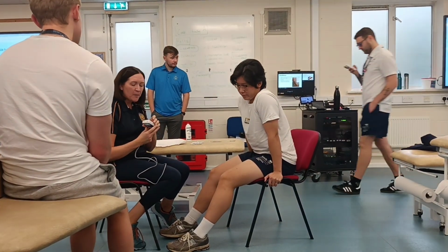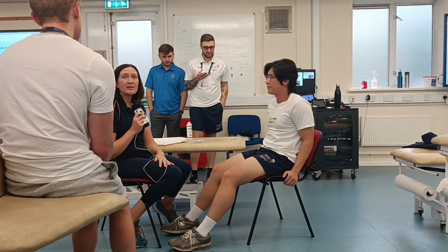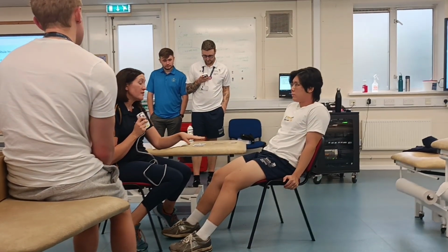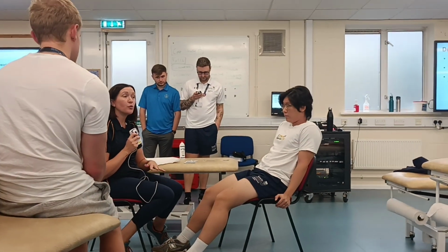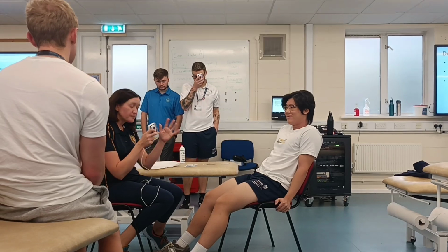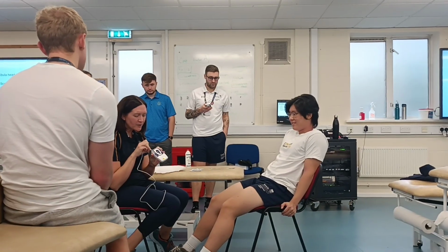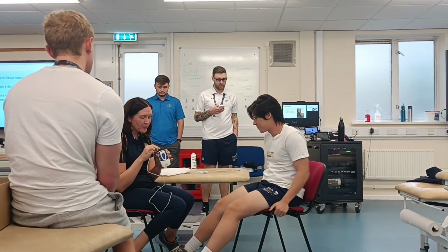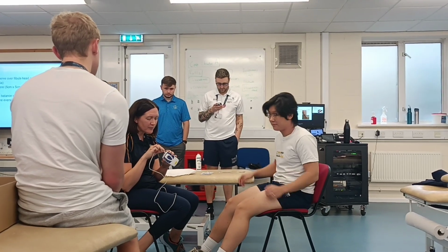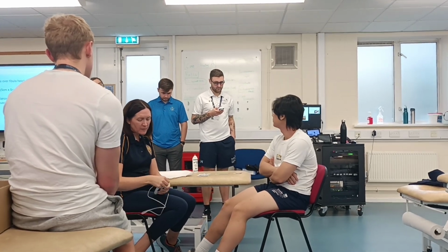Okay. It's got 2 channels, so sometimes I might put this on 2 muscle groups at the same time. We're going to look at quads. Sometimes I do put it on bilateral quads if I'm looking to strengthen, if I've got somebody with bilateral problems. Okay, so channel A, channel B. I'm going to put it into channel A, so we're just going to use one muscle group. Just a bit stiff there.